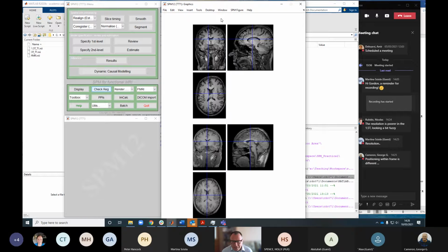So in an MRI scanner, the signal is proportional to the field, essentially. So if you get higher field, you get more signal, but the noise stays the same, so you get better signal to noise ratio. So at the bottom, the 1.5 Tesla scan has a lower signal to noise ratio, which makes it look a bit noisier.